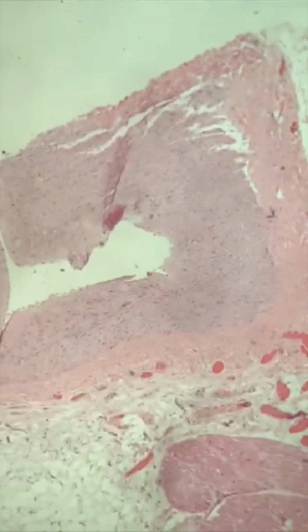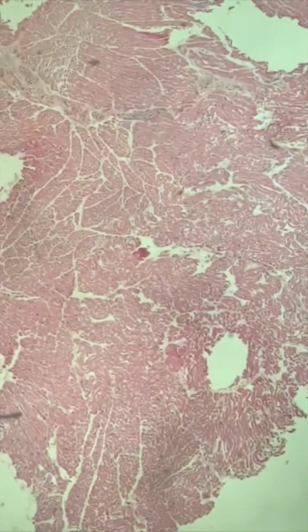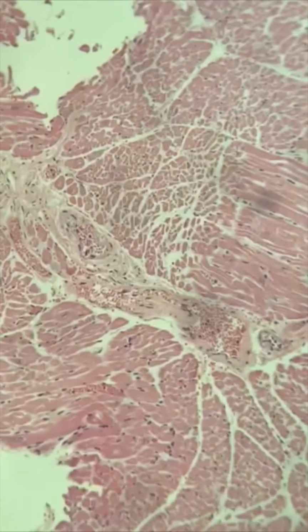So here's a section of the coronary artery. You can see that there is no significant plaque disease. We're going to go to the next slide. Oh, I think I got some myocardium on this slide. You can see that the myocardium is normal. Yeah, I think I did put some of the myocardium on this slide. Here's the myocardium. That's normal myocardium. No evidence of ischemic heart disease or acute changes of the heart, acute myocardial infarction like in a heart attack. So we'll go to the next slide.